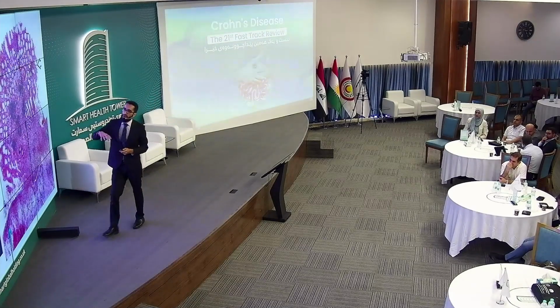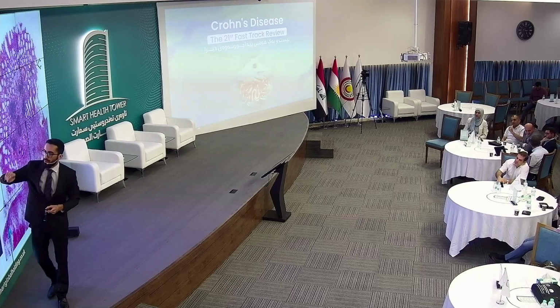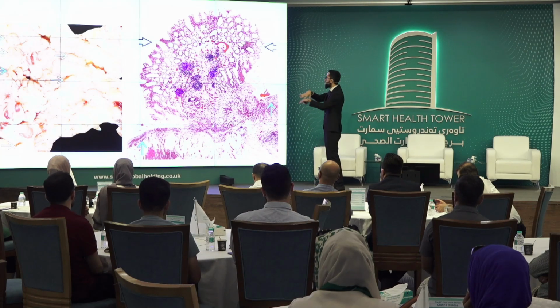Remember the cobblestone appearance that we mentioned? Sometimes it becomes so prominent that it forms a pseudopolyp. So it's not a true neoplastic polyp with a mutation. It's just an elevated, uninvolved portion of the mucosa with surrounding ulceration. And this is how we see it under the microscope.